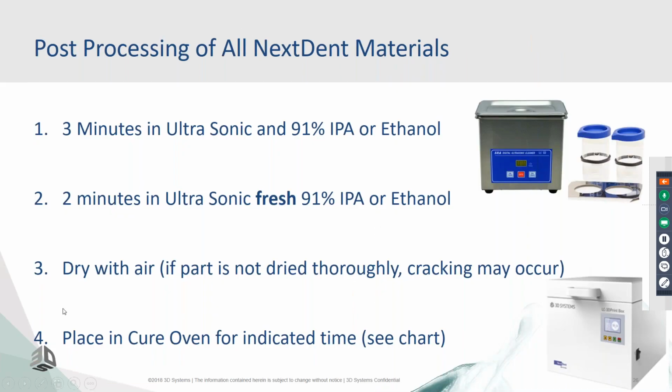So this is just a review. Make sure that you do your 2 minutes in the clean bath. If you're going to use model white or bleach, make sure that you don't mix that first dirty bath with something that was darker. You don't want it to be off colored.